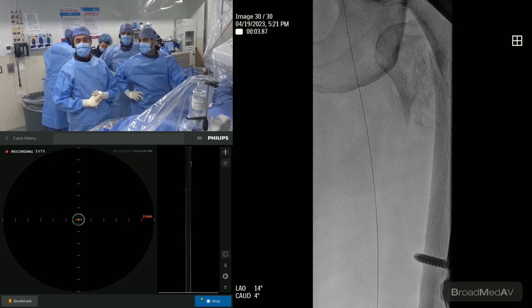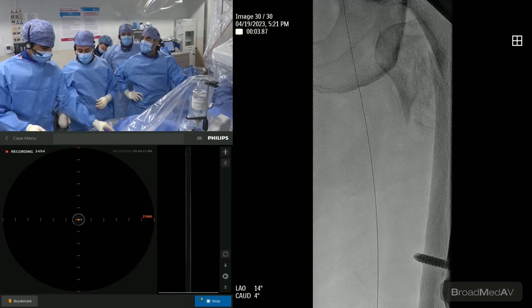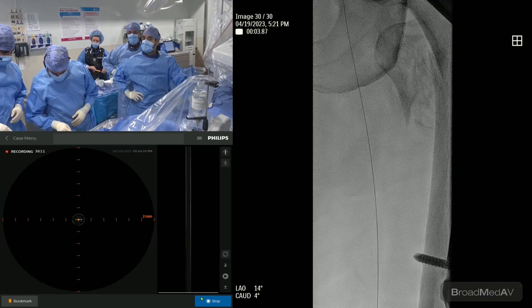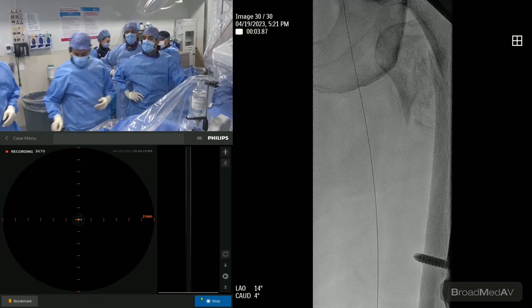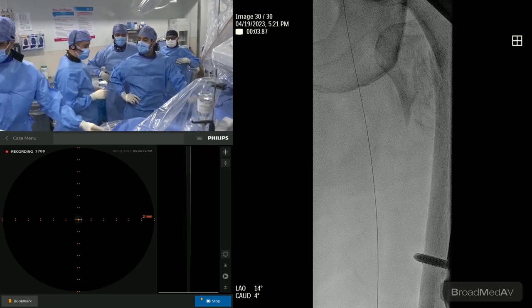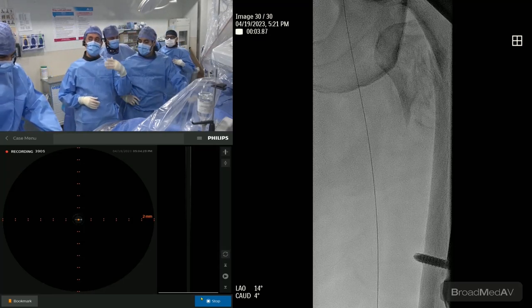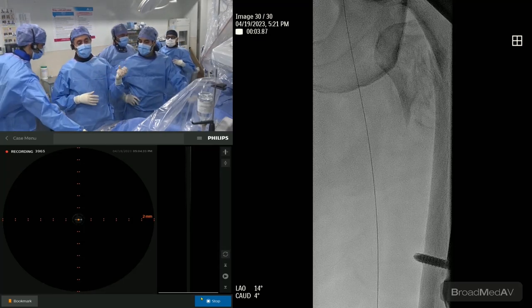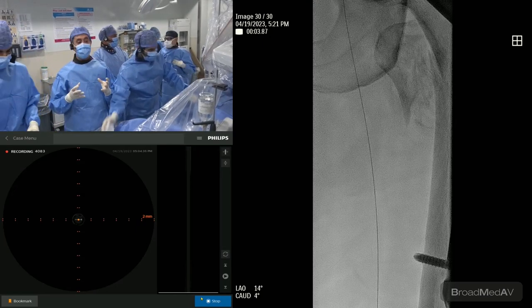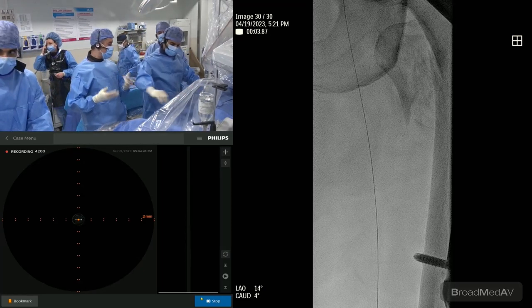So let's treat this vessel. What was the vessel size in that area? I'm being told it was about 5 to 6 millimeters. So what we're going to do at this stage is do an atherectomy and a balloon. And you could say, well, why are we doing atherectomy? So, Vishal, tell me about your treatment of choice. And then, Raman, what would you guys do? Well, in this case, you can see it's a lot of plaque in there. The degree of calcification is not that pronounced. But because of plaque modification and getting enough luminal gain, I'm a proponent of doing an atherectomy.